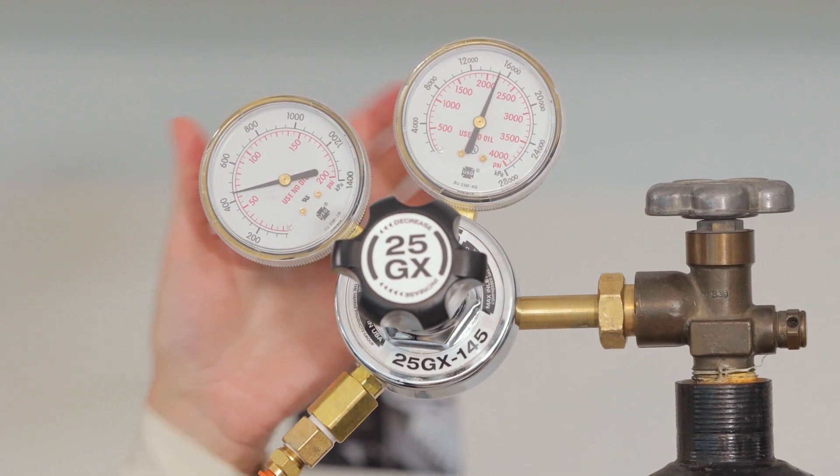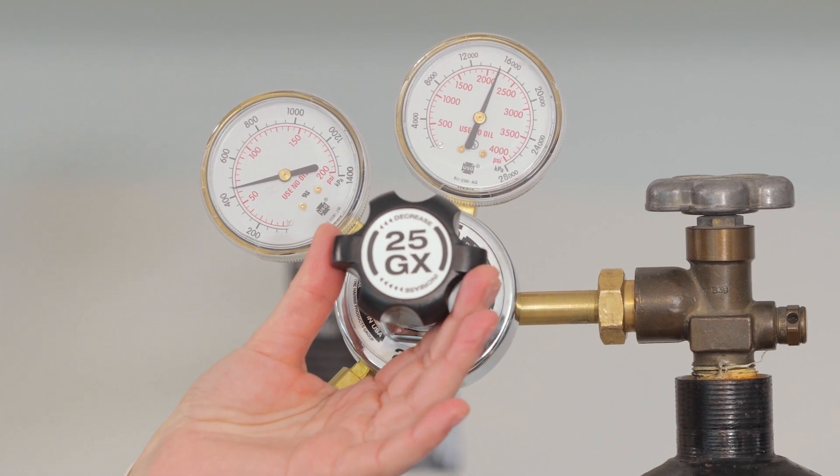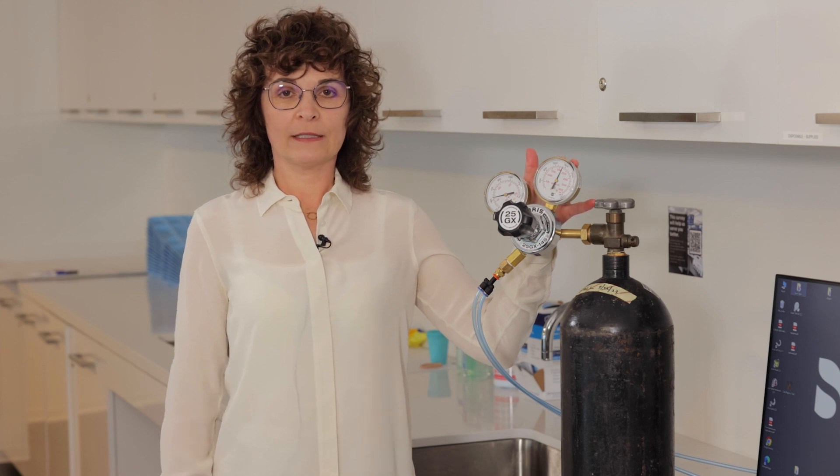You can turn off the nitrogen valve at the end of the day; however, this is not recommended. We do not recommend that you do this. Always notice the remaining psi on the gauge on the right.